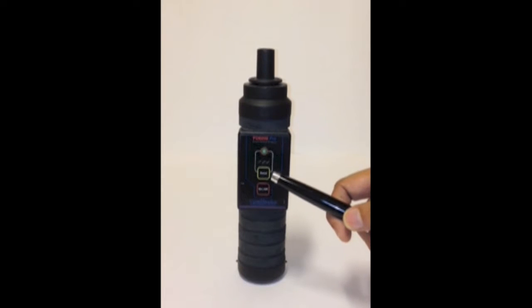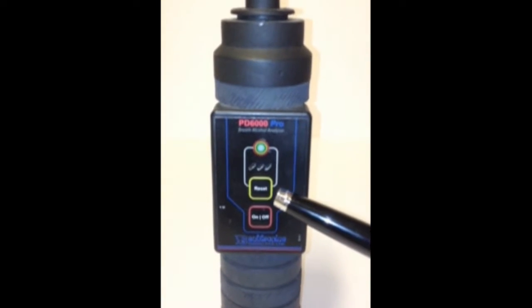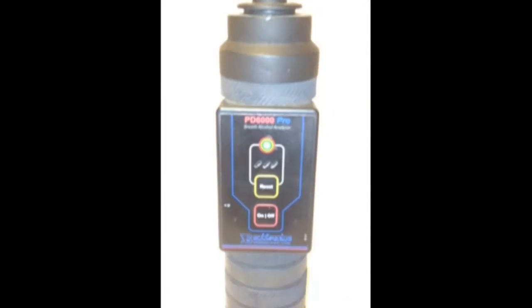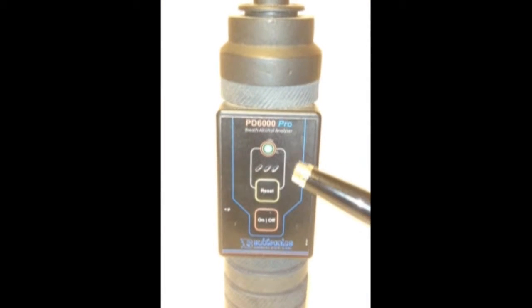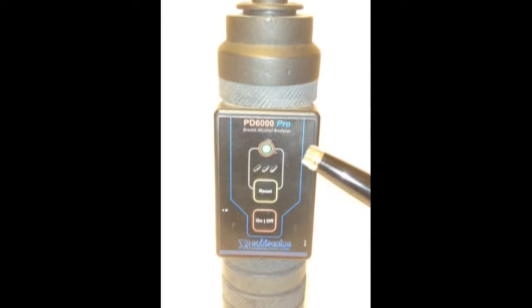The second switch is the reset switch. This switch is used while resetting the alarm once the alarm is triggered. Moving on to the indicator level, this is a tri-status indicator, meaning the same light shows you three different statuses.